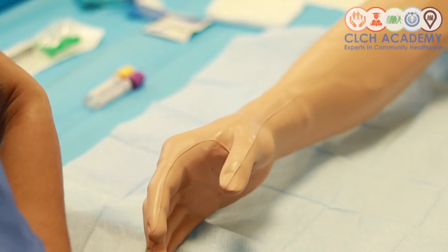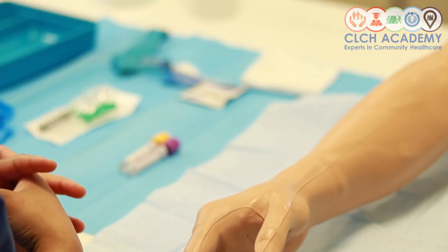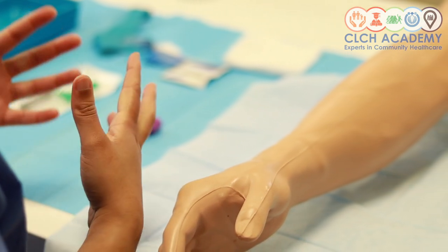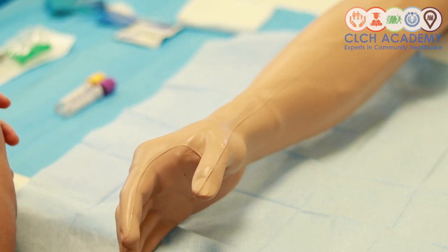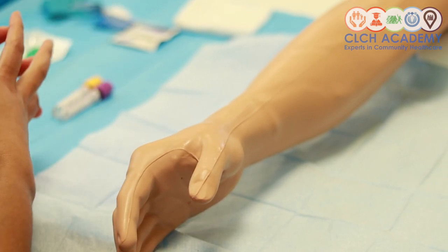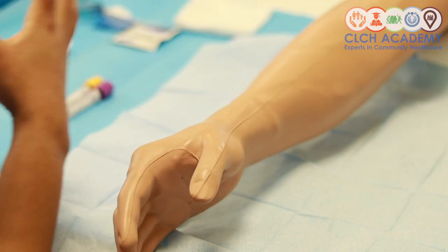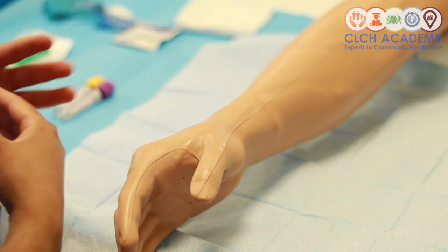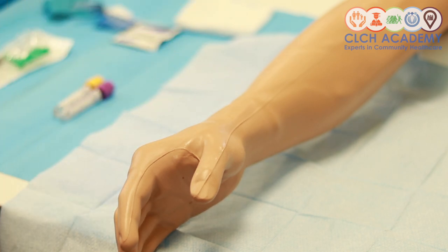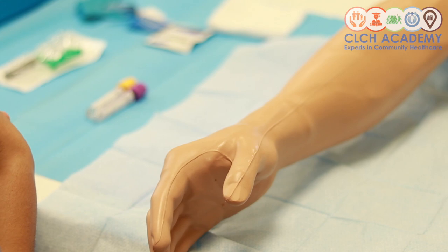Okay. Once again, I'm going to demonstrate venipuncture collection. However, in this particular scenario, I'm demonstrating collection from the hand, as we've got some localized infection in the antecubital fossa, which is making it difficult for us to access, and our patient potentially has fluids going through the other hand. So I'm going to head for the hand because that's the best place to collect the bloods for this patient in this situation. I'm also going to be demonstrating the technique that you would roughly use within an inpatient bedded area.